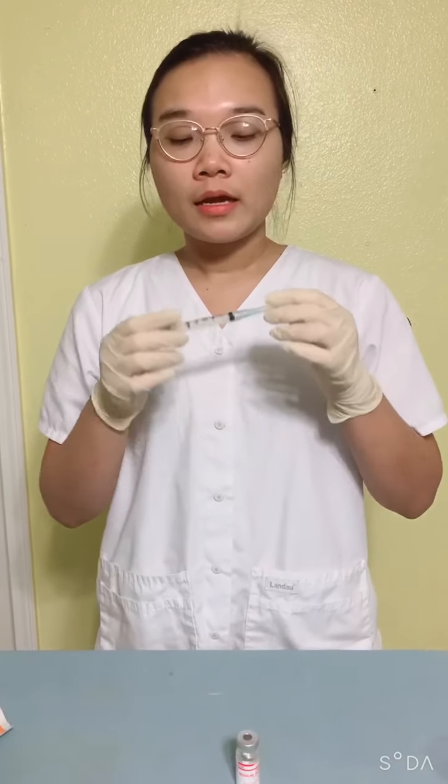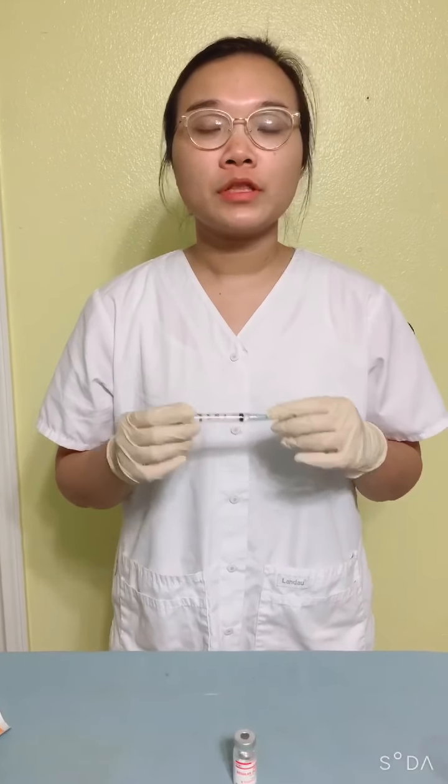After labeling the syringe, I would go into the patient's room and perform a third check. Then I would explain the procedure to the patient, identify sites, clean the site with alcohol swab using circular motion. Then, using the Z technique, I would insert the needle into the patient's skin at 90 degrees. Aspirate, slowly administer the medication, 1 milliliter over 10 seconds.